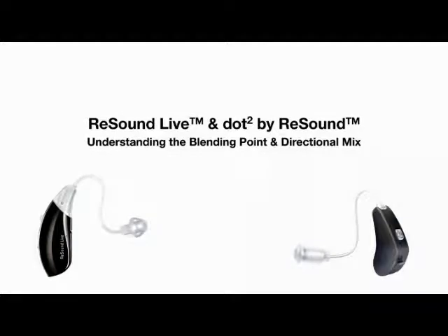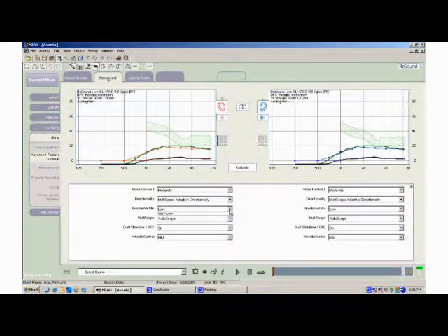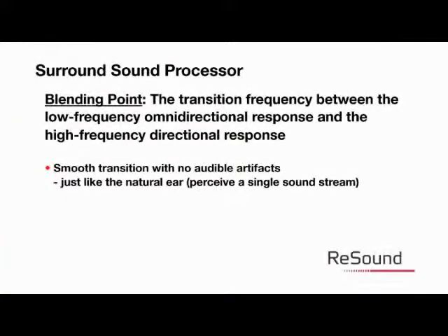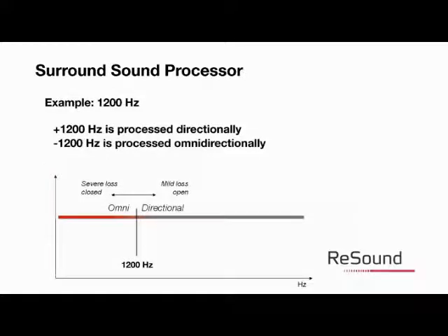The number of frequencies processed in an omnidirectional and directional pattern can be personalized by the hearing healthcare professional in the Aventa software. The ability to adjust the directional mix allows for further personalization of your patient's fittings. The blending point is the transition frequency between the low-frequency omnidirectional response and the high-frequency directional response. It is a specific frequency, for example, 1200 Hz. In the example of 1200 Hz, anything above 1200 Hz would be processed in a directional pattern, and everything below 1200 Hz would be processed in an omnidirectional pattern.